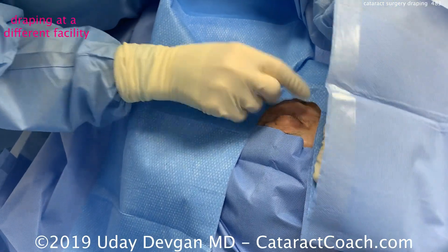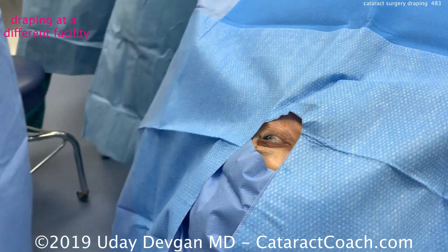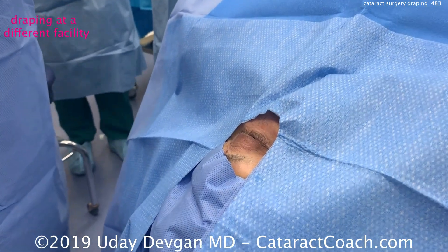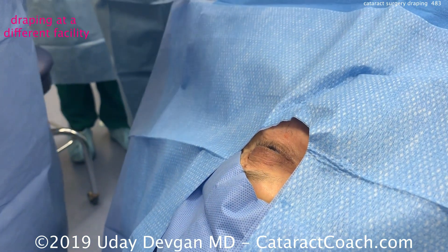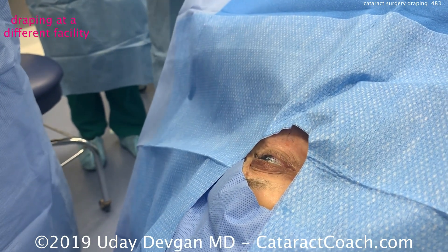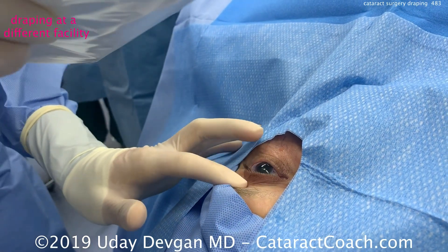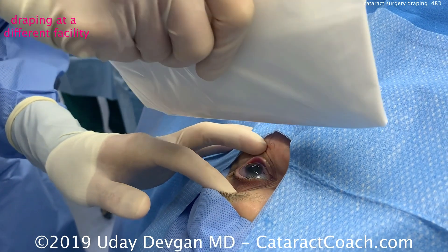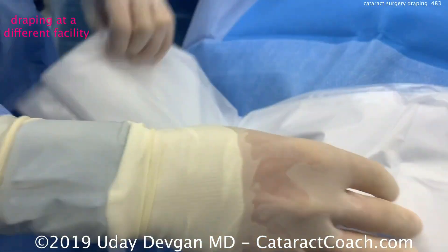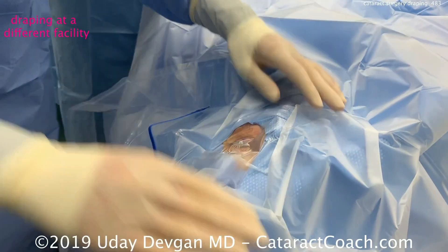Here it's being done in a different facility — not our Beverly Hills center, and not me doing this procedure — but I wanted to show a different technique. The patient's eye is again exposed, and the surgeon is going to get a plastic drape. The skin has been prepped with povidone-iodine. He's going to use his actual fingers touching the eyelid skin, which has been cleaned with the betadine solution, then put the clear drape down and open it up. This is perfectly acceptable also.